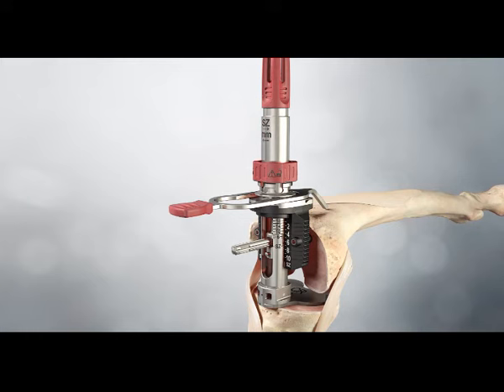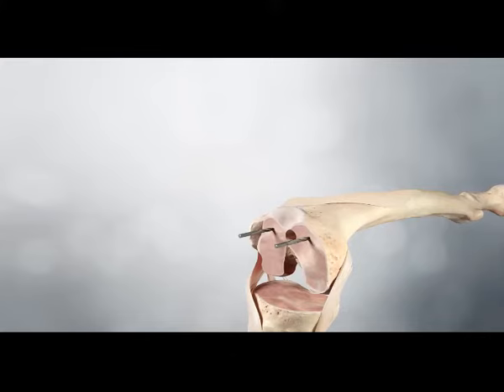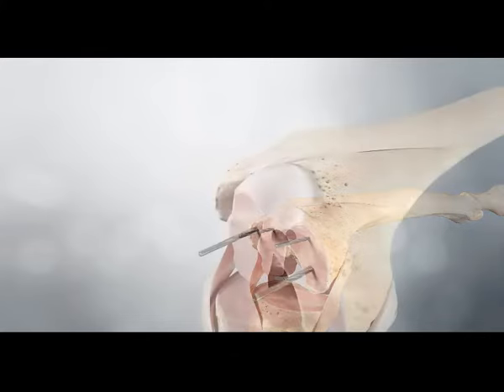Lock the assembly in place by rotating the locking knob clockwise. Insert universal pins into the pinholes on each side of the sizing scale. The sizer is removed by unlocking and releasing the tension. The IM rod is removed with the tapered plug.